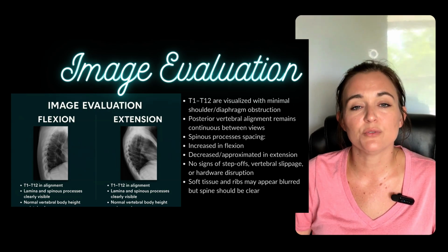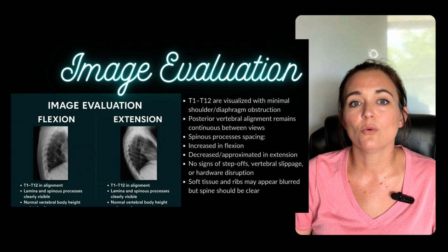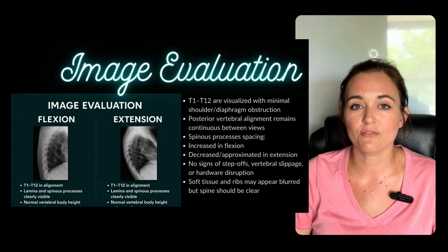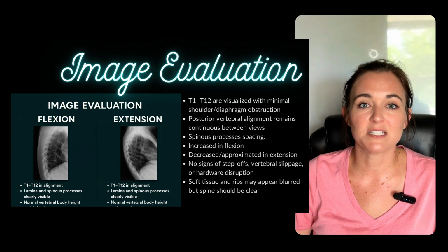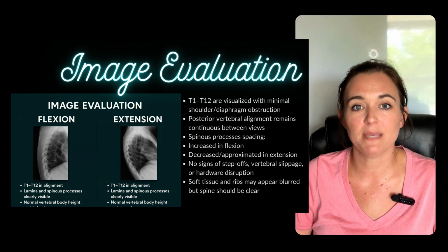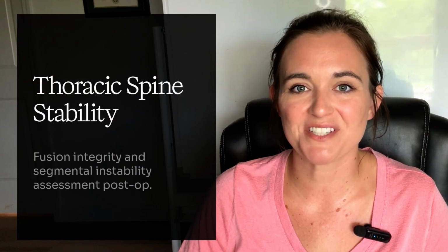This is a great view to evaluate healing or failure of spinal fusion, early signs of kyphosis or vertebral collapse, or unexpected hypermobility between segments. A lot of newer techs see minimal movement and think they did something wrong. Here's an ARRT board tip.